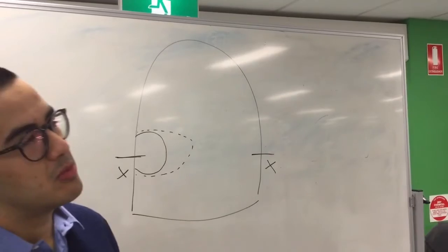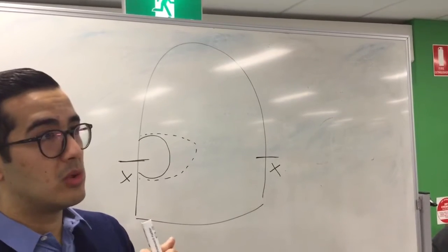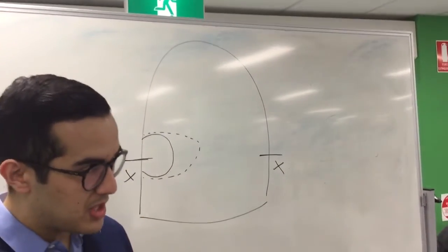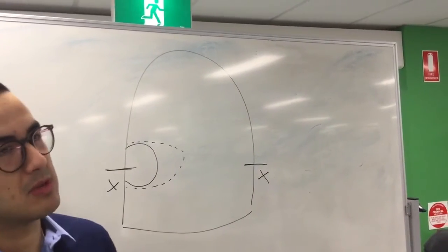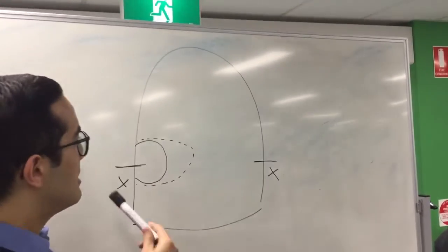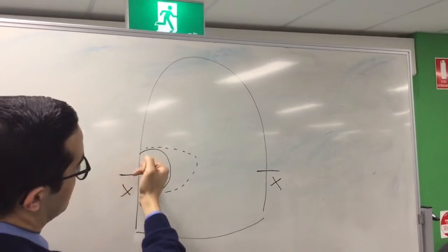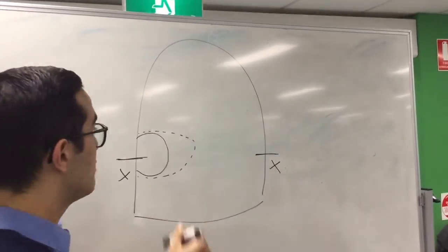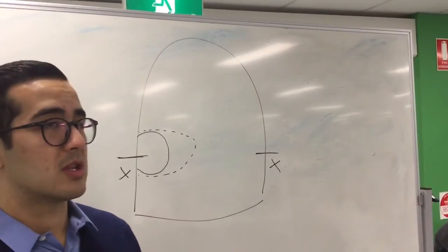Now, the easiest way to determine whether or not you've passed through the contact point interproximally: remember how last semester, if anyone had me, I would say I want you to look for that little gap between the two teeth. If you can see rubber dam, because it'll be green because it's flossed interproximally, then you know you're pretty much through that interproximal wall. It's quite similar, but the major difference today is, because there's no rubber dam here, what you're looking for is literally a little bit of light. If you can see a little crack of space in between the two teeth, then you know you've gone deep enough interproximally that you've broken through that wall properly and you've involved the contact point.